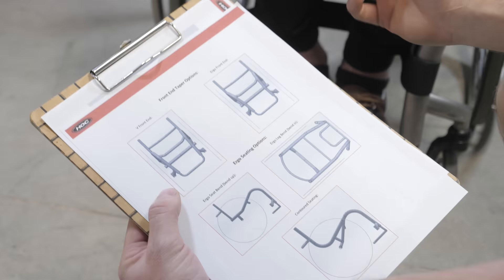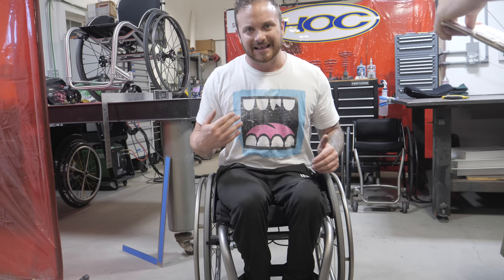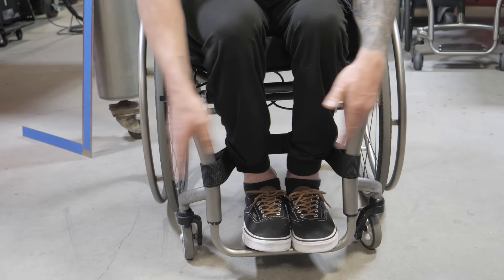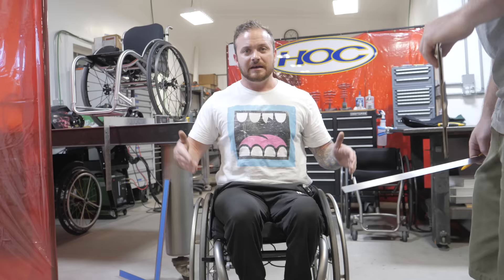That's the move! So now we're going to take the front of chair width, which is going to be a lot smaller than the rear width — the reason I chose that is because I like a taper to my chair. The difference between front end styles is just aesthetic; it depends on what look you like best. I like a taper, which means from the front it kind of tapers in, so my feet don't fly all over the place. It makes you have a more slim and slick figure if your front taper is tighter.